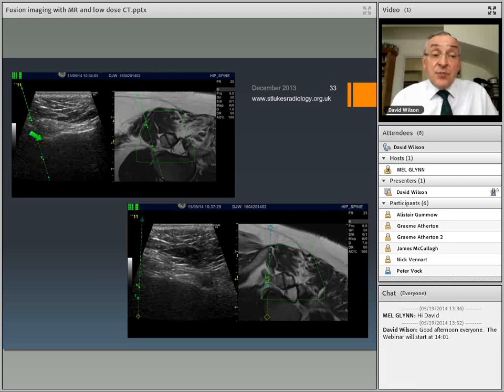We're predicting with this line where it's going to go. You can see the movement artifact in real time on the ultrasound, but actually it's the guidance system that tells you more about it. By rotating the probe to a different angle, which you can do at any stage during the procedure, you have the needle in one hand, the probe in the other, we can now see that the needle tip has come down to the N, about 1 millimeter away from the nerve root here, and that's our target point just on the nerve root. We don't see it clearly on the ultrasound because it's really hard to see using ultrasound. That way we can place the needle within about 1 millimeter of the structure we want.